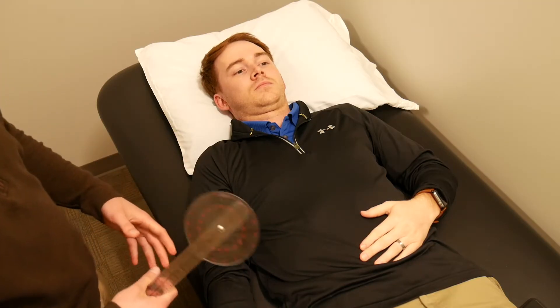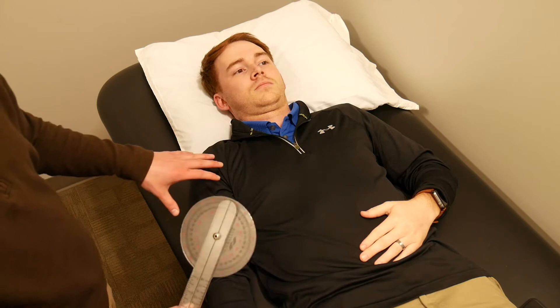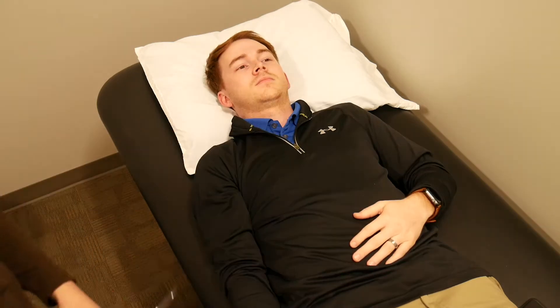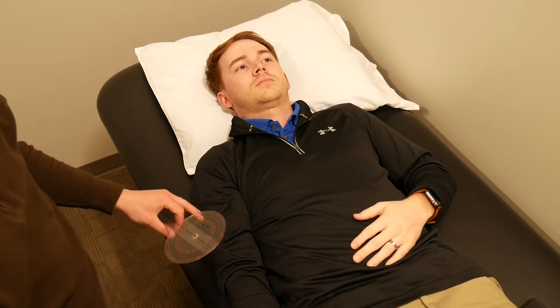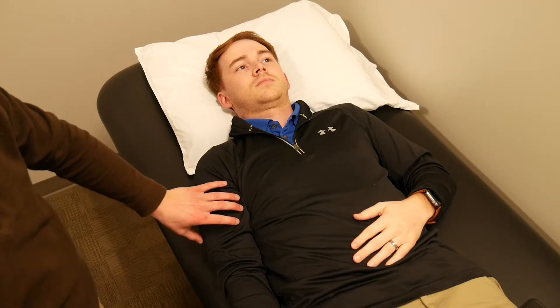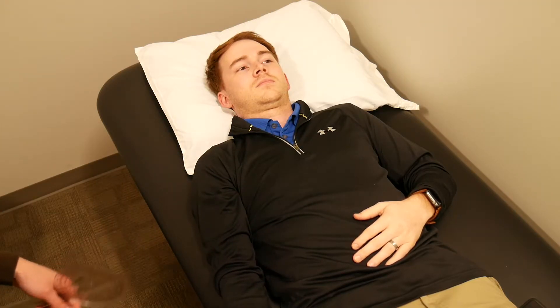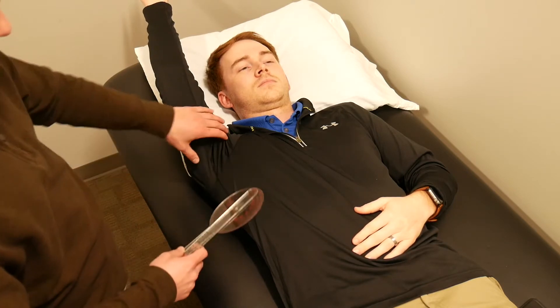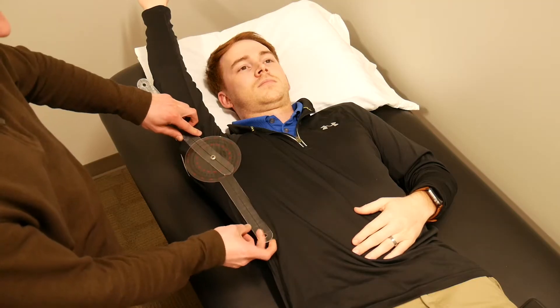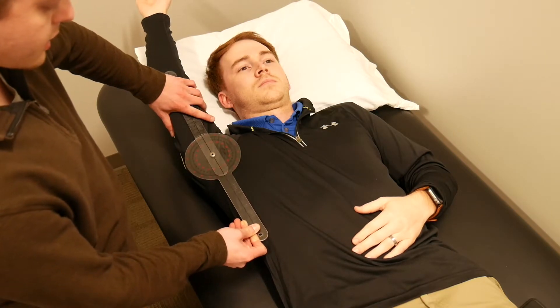You can follow with the goniometer, or if you prefer, you can have the patient move into the desired position first and then place the goniometer to measure — just make sure your landmarks are correct. Also note that as the patient moves into shoulder abduction, make sure they are thumb-up into abduction and not thumb-down, so the humerus is externally rotated and they can get full range of motion without impinging at the shoulder. So place the axis over the acromion, stationary arm parallel to the trunk, movable arm in line with the mid shaft of the humerus, and there is your measurement for shoulder abduction.